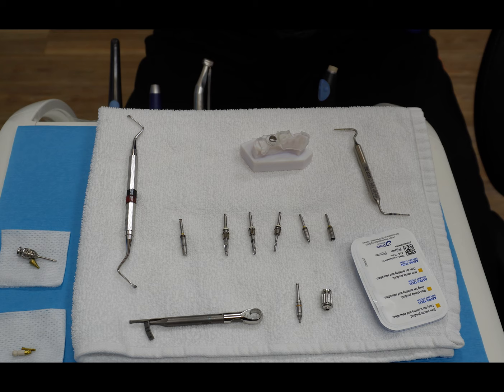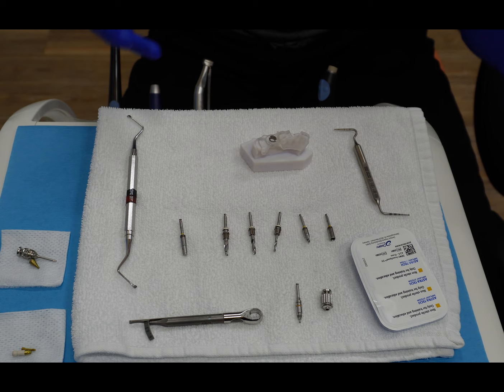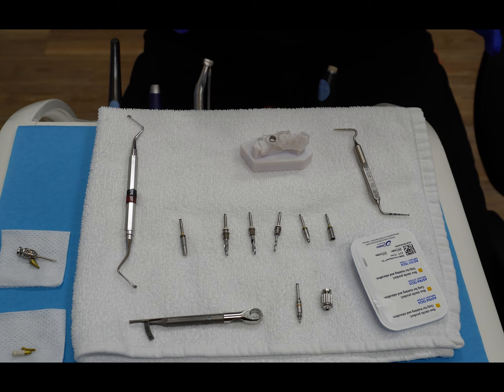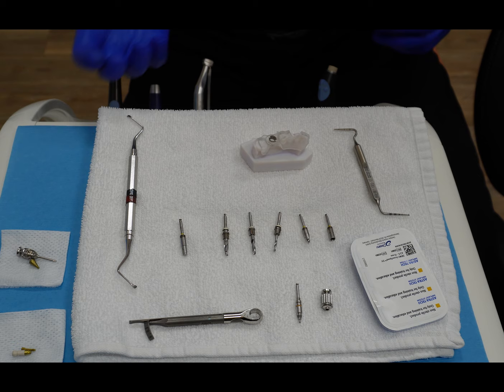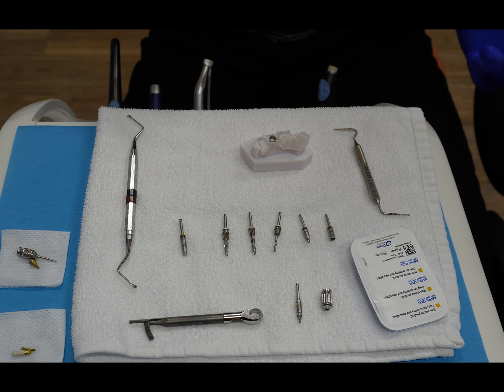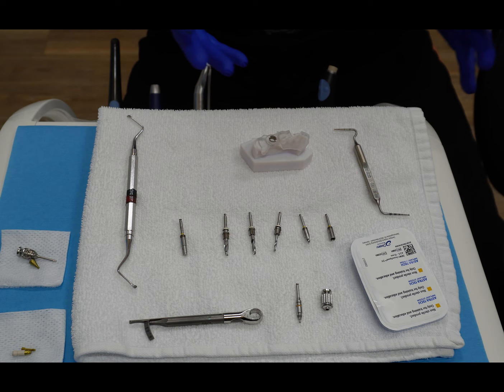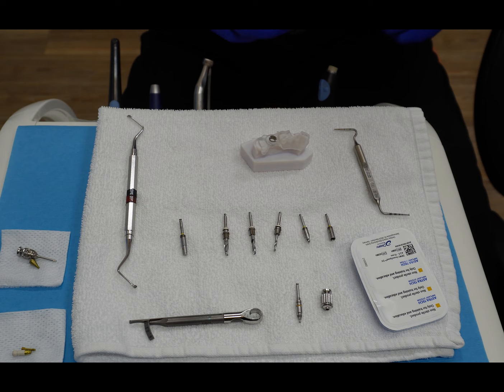We've got our healing cap and the corresponding screwdriver. If we want to utilize a workflow where we're using the scan body immediately, we have our intraoral scan body — we can place the implant, and if we're happy with the tissue profile we place that on and scan. A few months later after osseointegration we're ready to put a permanent restoration on, or if you want tissue conditioning and place a temporary crown in the next few days, you could certainly do that. We'll demonstrate that momentarily.